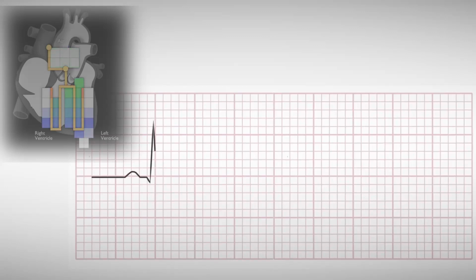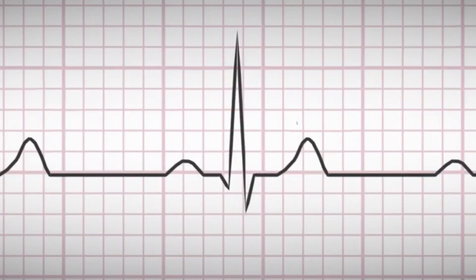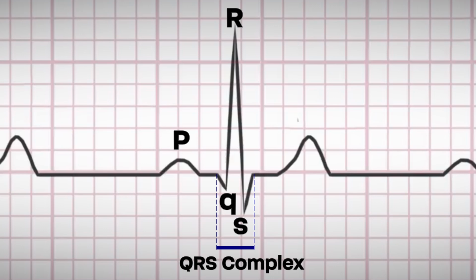On a very basic level, I've already shown you what a normal EKG tracing looks like. We have a normally round, upright wave that's formed by atrial depolarization, followed by some bigger, sharper waves that correspond with ventricular depolarization, and finally, a rounded wave that corresponds with ventricular repolarization. To be direct about it, those waves are named P, Q, R, S, this bit together is called a QRS complex, and T. That's the convention we've got, and to some extent you'll need to remember that, but hopefully that series shouldn't be too complicated for you.